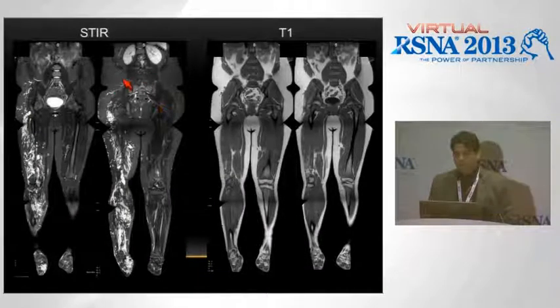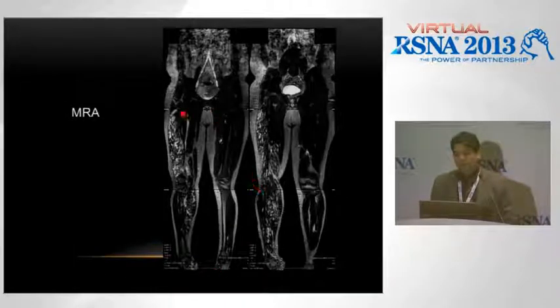This is an example of a patient with Klippel-Trenaunay syndrome, where you can see that the right lower extremity is entirely replaced by these hyperintensities, which are really dysplastic venous structures. And it clearly guides the interventional radiologist in treating these patients, because they can, in one go, see the extent of the malformation. Then when you couple it with an MR angiography, time resolved with temporal undersampling using a technique like keyhole or TRICKS, and get the dynamic times to less than a second, we're able to look at AV fistulae running to these lesions, and tiny arterial feeders going to these lesions.